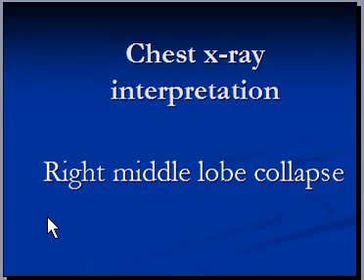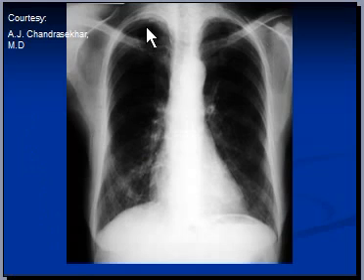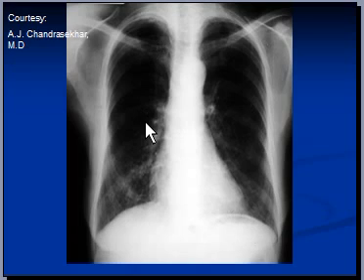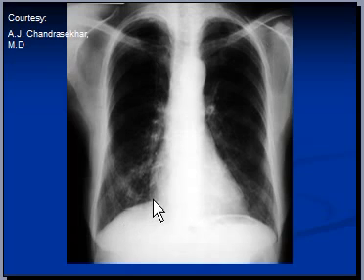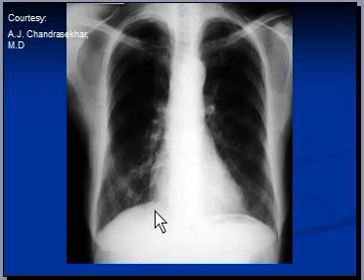Chest X-ray interpretation: right middle lobe collapse. In this chest X-ray, both lungs are hyperinflated, meaning they have increased volume as a result of loss of elasticity, and they appear darker, which is an indication of COPD — chronic obstructive pulmonary disease. Other than that, there is a certain opacity in the right lower lung field. If you look closely, the medial border of the right hemidiaphragm is slightly raised and the right cardiodiaphragmatic angle is a bit more acute as compared to the left. This is an important clue.